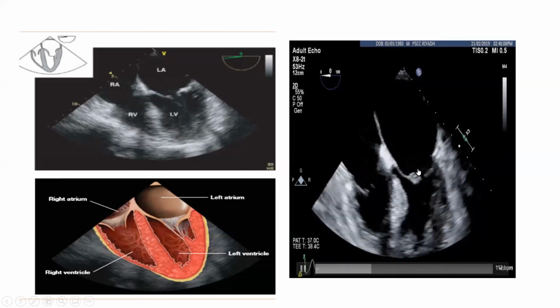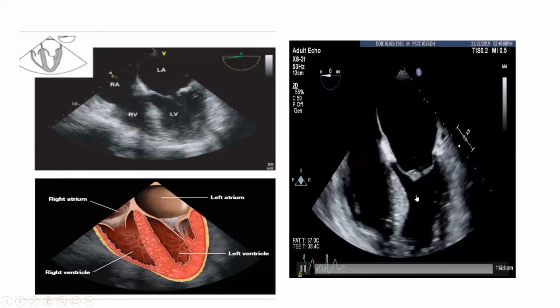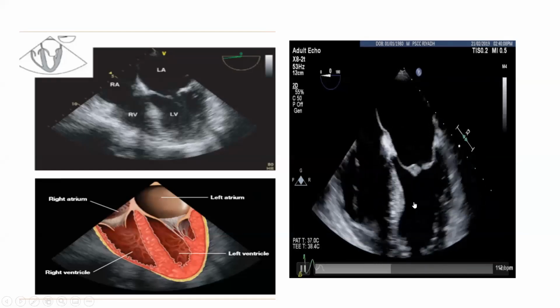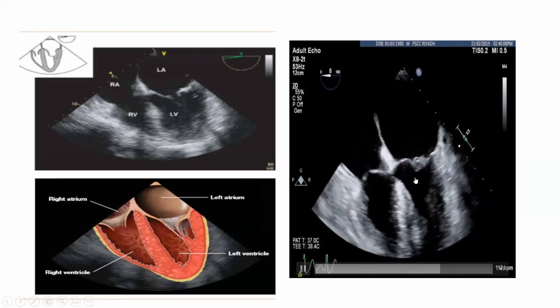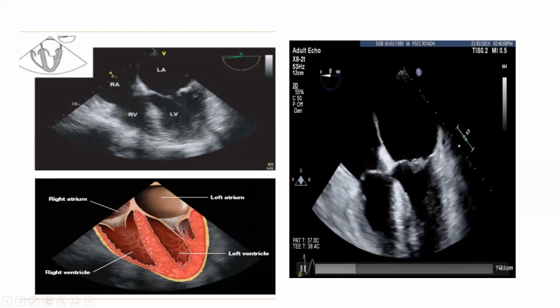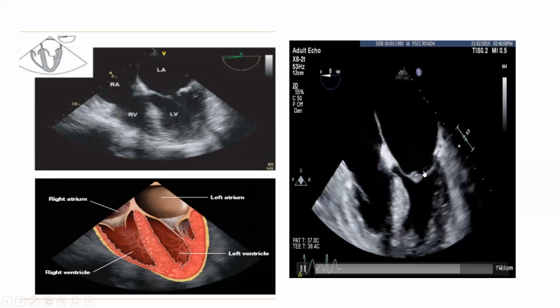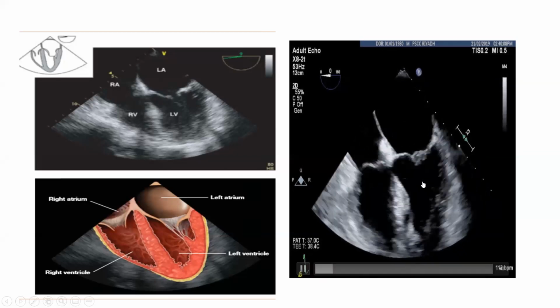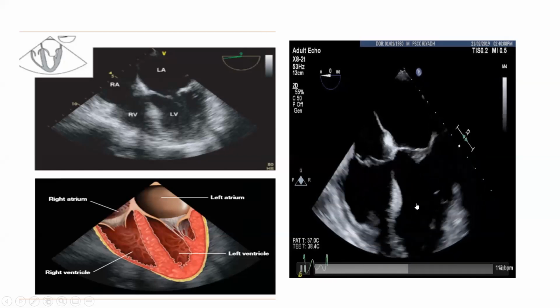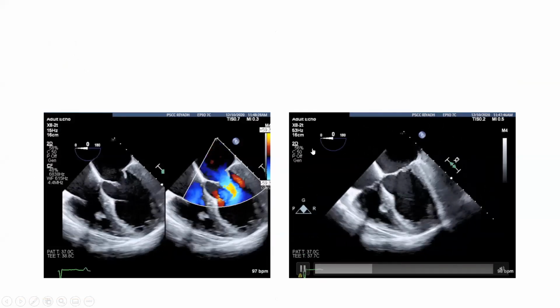When we did this TEE, we said, "You have severe stenosis. Let us give you time and reassess you again after maximization of the anti-SLE medication." They gave all the immune-modulating medication. After a while, all these masses disappeared, and instead of severe stenosis, it became severe mitral regurgitation. So it's Libman-Sacks endocarditis.